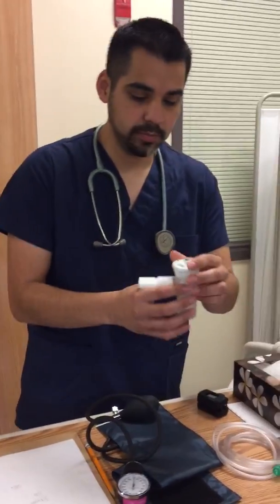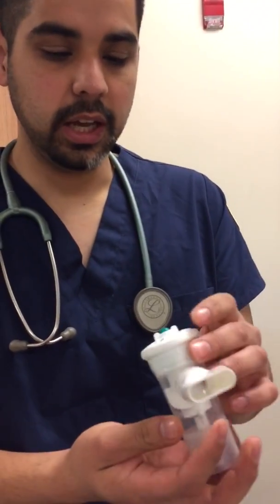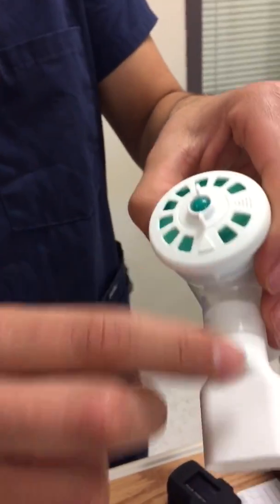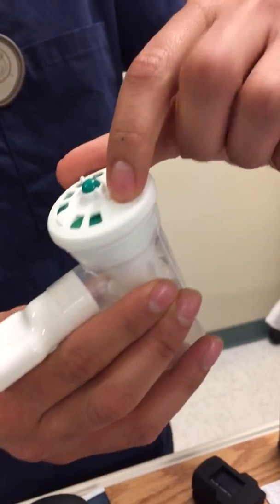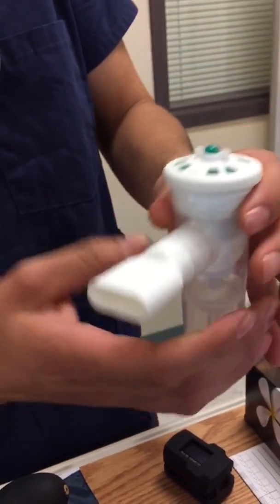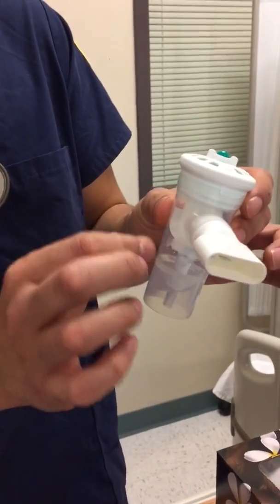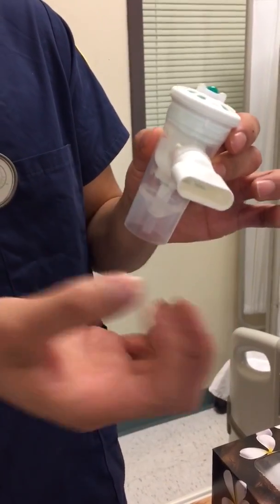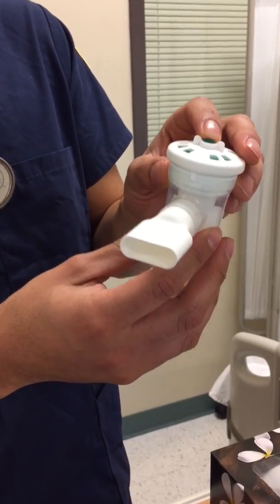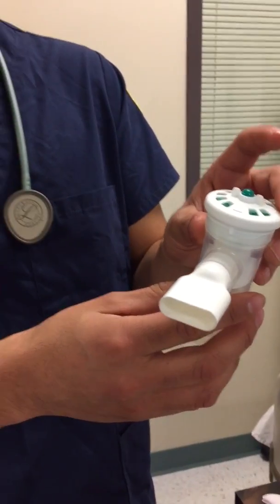I want to note too what this looks like. So this is an Aero Eclipse small volume nebulizer, and it has 2 modes. One right here, the solid triangle, means it gives out continuous nebulization, and the dotted one means breath actuated. So what happens is that you can see the green ball pop up every time. This is basically how this works: the aerosol, the drug, is propelled on the patient's breath. So every time the patient breathes in, the ball will go down, and that means it's opening the drug, and then closing off when it goes back up.